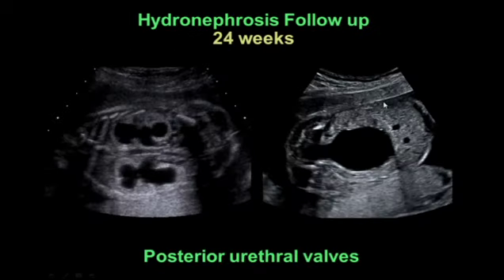But on follow-up scan at 24 weeks gestation, we now had mild oligohydramnios, so the replenishment of amniotic fluid had diminished, and we now had severe hydronephrosis of the kidneys on each side and a dilated urinary bladder and a dilated posterior urethra. This was a case of posterior urethral valves that presented itself later in gestation.